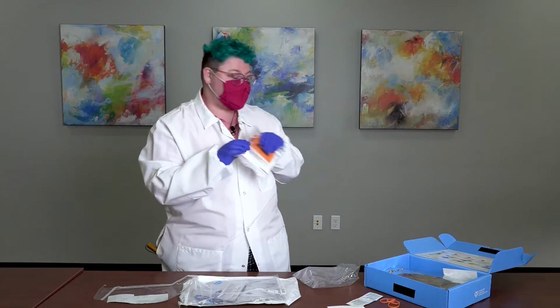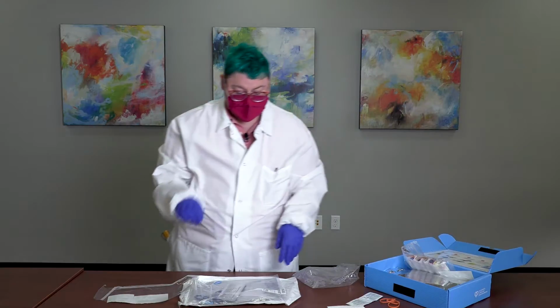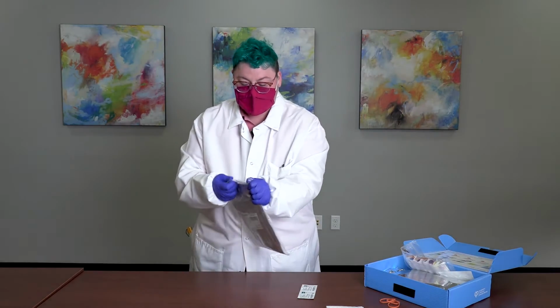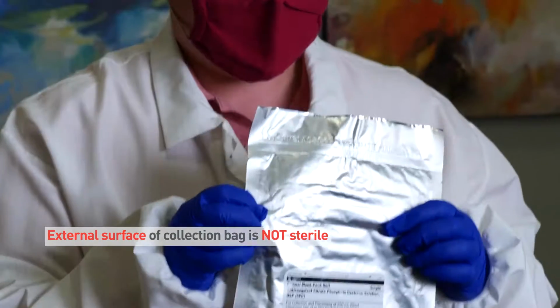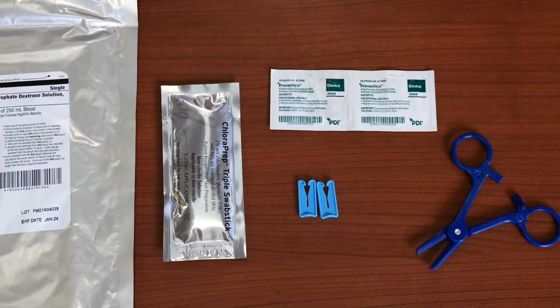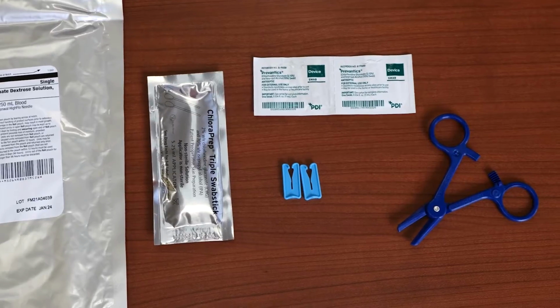These can be set into the box, so you remember to package them with the cord blood unit. When you're ready to do the cord blood collection, you go ahead and open up your supplies here. These supplies include the Fresenius Kabi collection bag. This must only be used for vaginal deliveries. Additional supplies include a hemostat, 2 blue clamps, a ChloraPrep swab stick, and 2 chlorhexidine swabs.